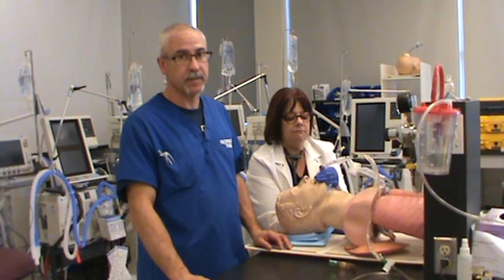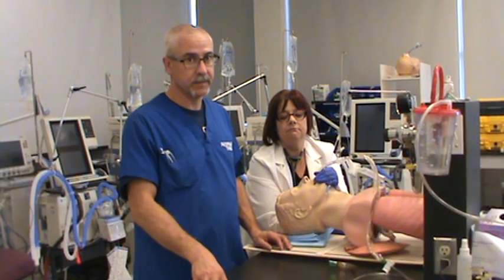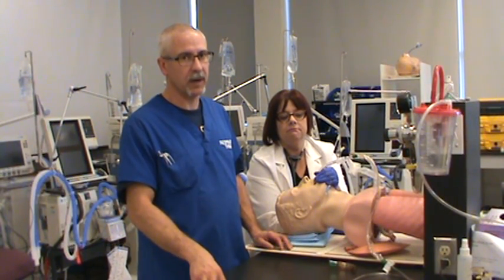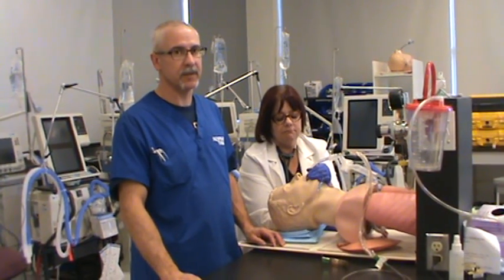If you remember the order for oral intubation, it's bottom top, top bottom, top tube. The top tapes are always going to go on the tube, the bottom tapes are going to go on the patient, and you always start taping from the side that the tube's located on.